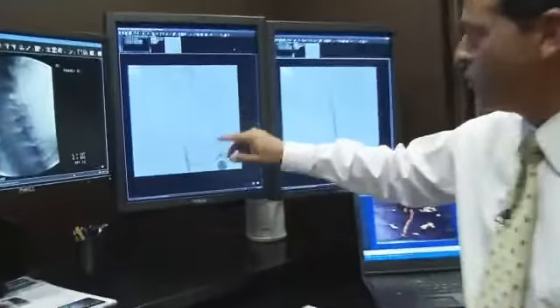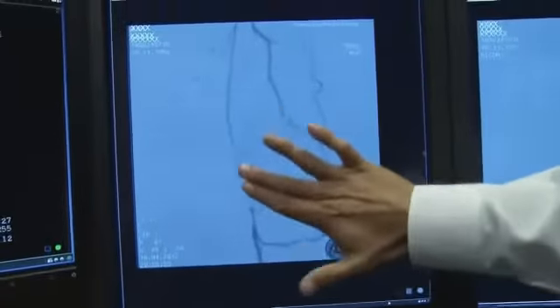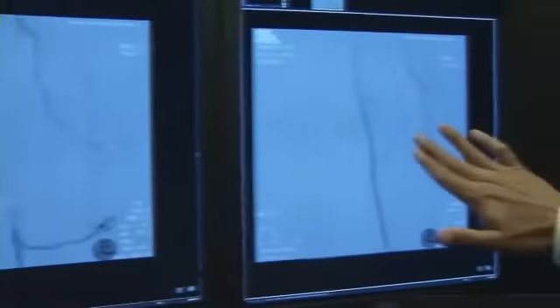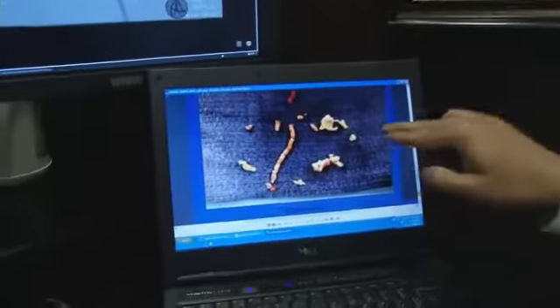Before and after images really say it all. Take a look — this is the before, and you can see the blocked artery right here; it's very faint. After the one-hour TurboHawk procedure, you can see the blood flowing nice and smooth. And this is all the junk that came out — this is the plaque.